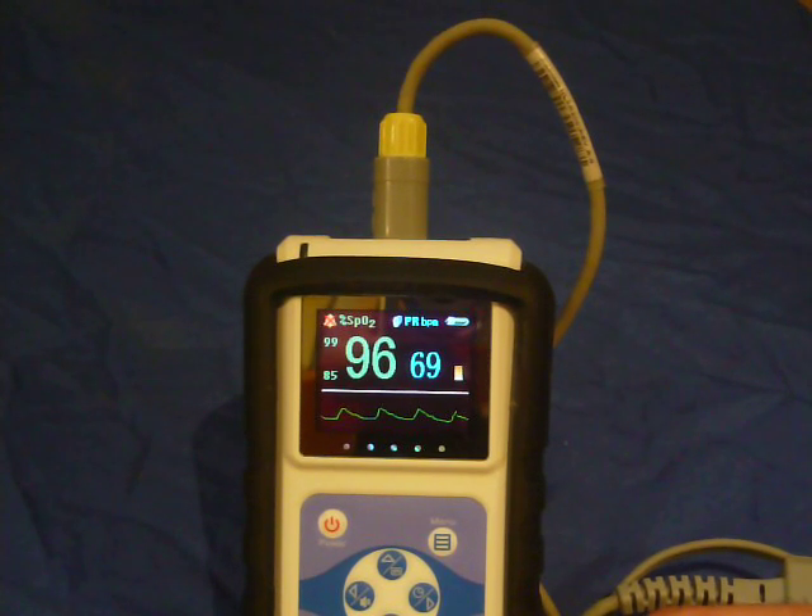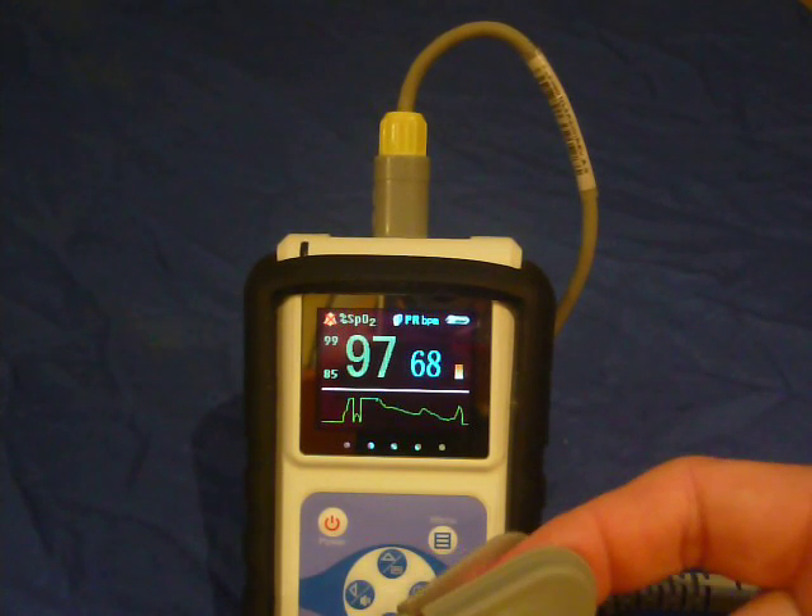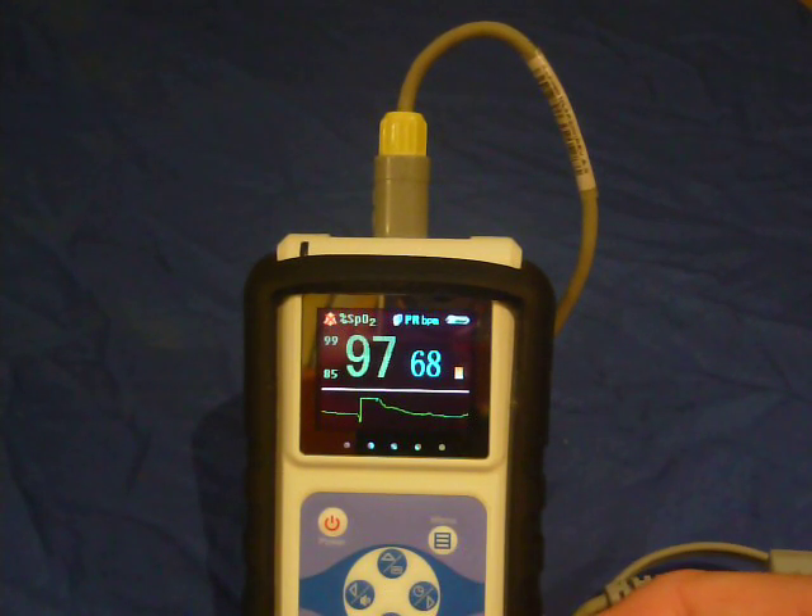Here is the best-selling Vetsense P02 veterinary pulse oximeter. There are 60 units around Australia, mostly in Queensland, thanks to ZebraVet who did a great job as distributors.